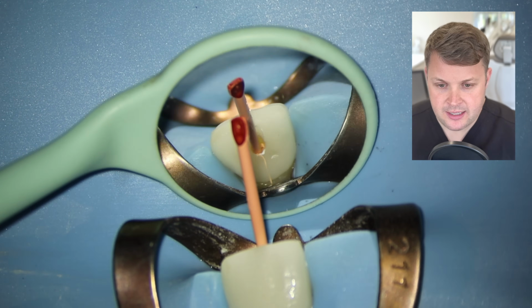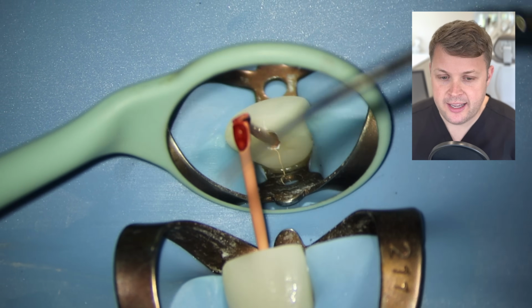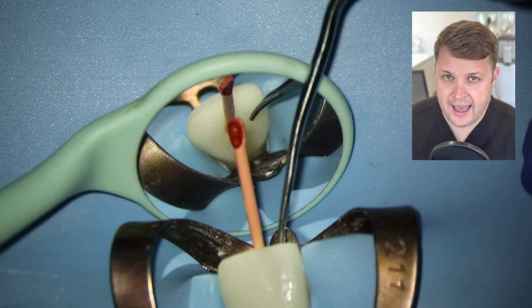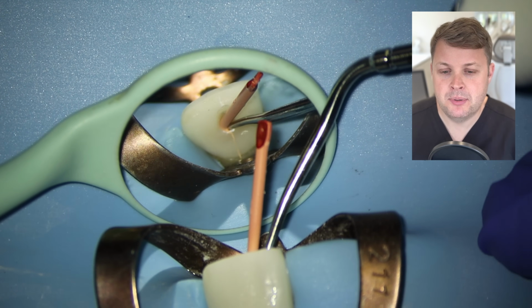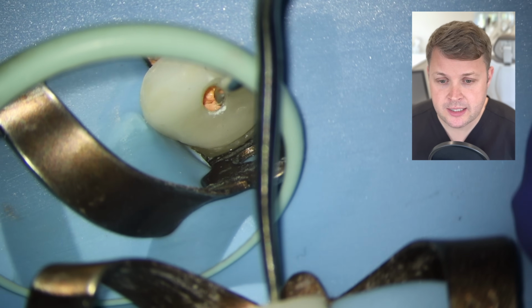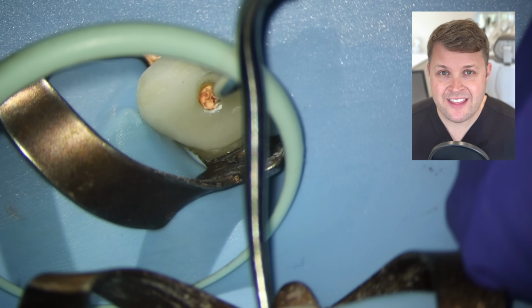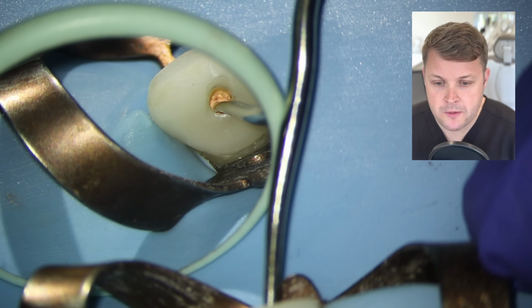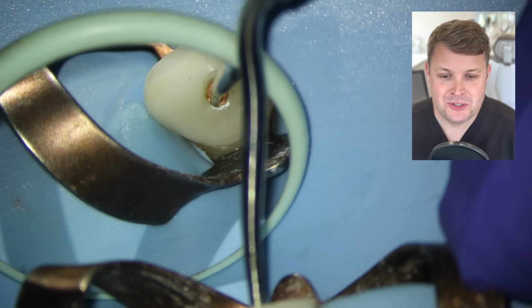I'm going to disinfect it, and what I notice here, as I push this accessory cone to length, is it actually goes quite far down. So I'm quite happy that I've placed this GP cone in place. And to be honest, I've backfilled this tooth completely, and I've probably filled it really, really nicely. But on occasion, I have not placed an accessory cone, and there's been voids, and it's always very, very annoying. So, you know, it doesn't cost much to put another GP cone in.